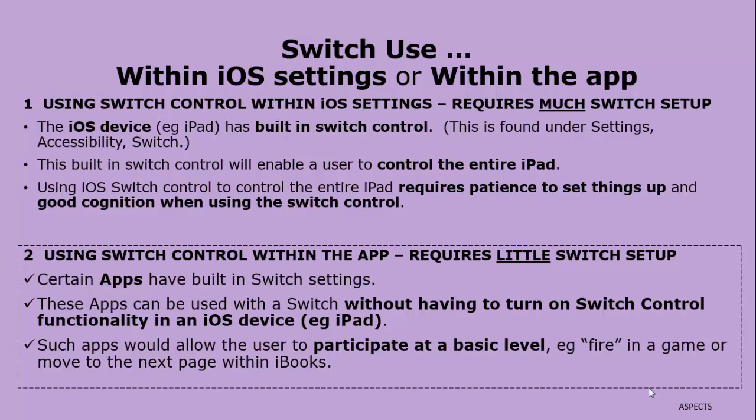The iOS device, for example iPad, has built-in switch control. This built-in switch control will enable a user to control the entire iPad. Using iOS switch control to control the entire iPad requires patience to set things up and good cognition when using the switch control.